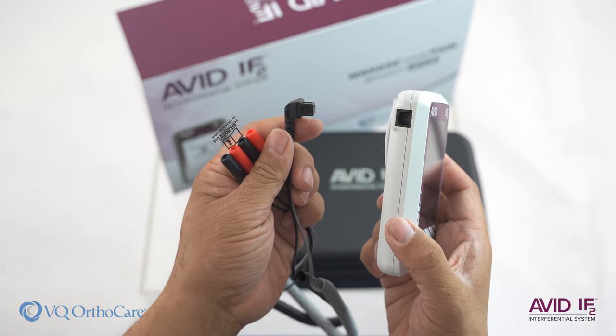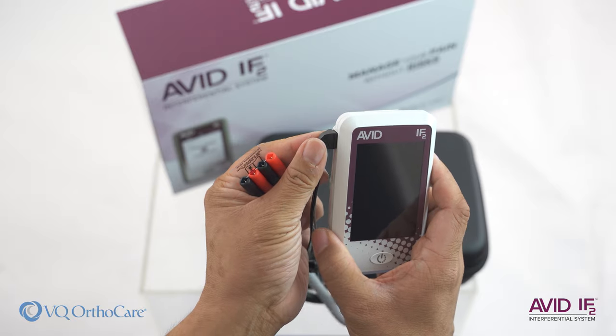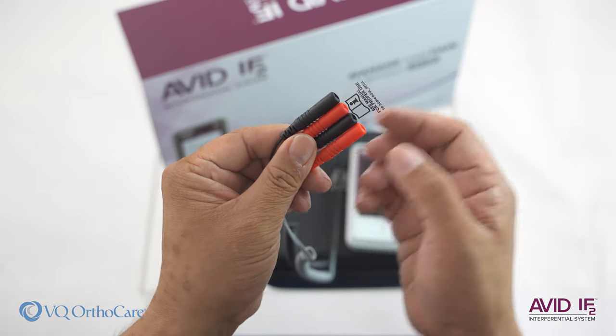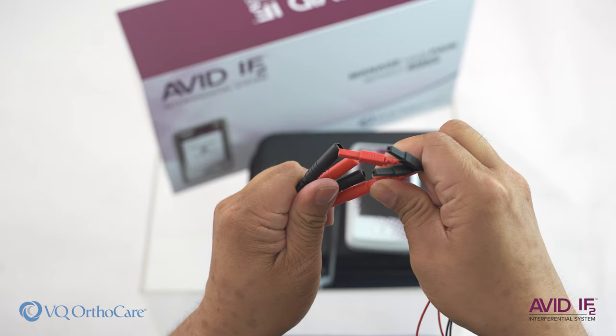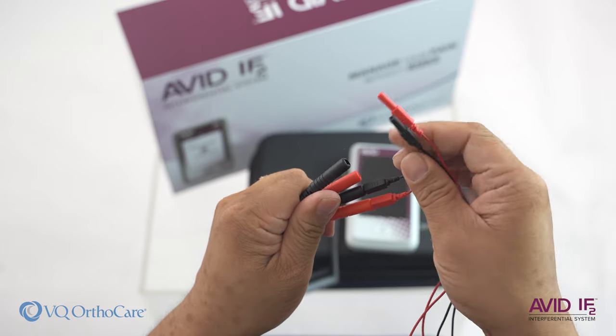First, plug in the lead wire to the left side of the device. You can discard the plastic plug used during shipping once you have read the directions in the manual and quick start guide. Then, attach the electrodes to the lead wire, matching red tip to red tip and black tip to black tip.